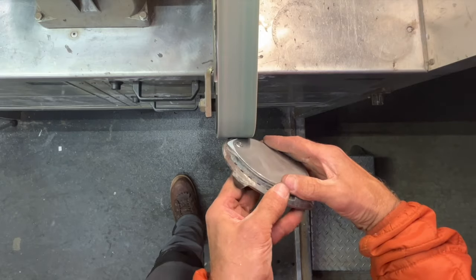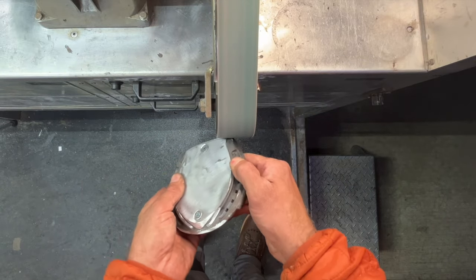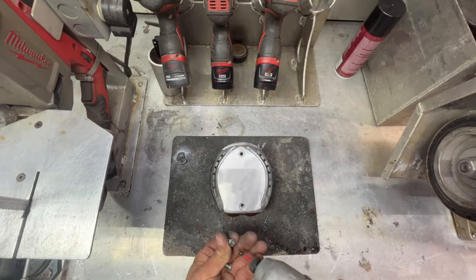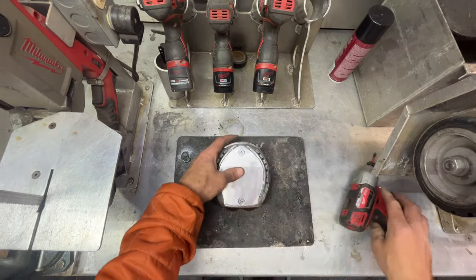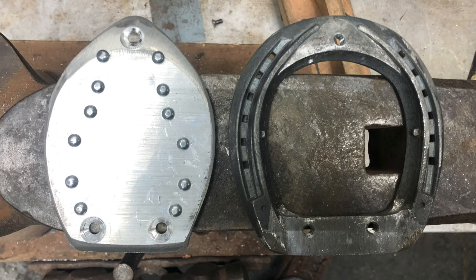So here we are — we have a low profile hospital plate that allows us to have some leverage reduction in our shoe. We were a bit concerned when we finished that this could be a little bit slippery, so I added some screws to the plate to help with traction. You could also use some carbide tungsten pins.